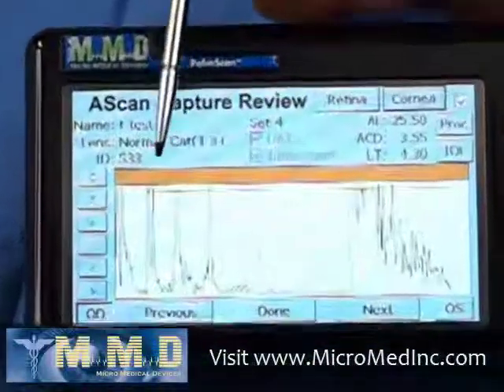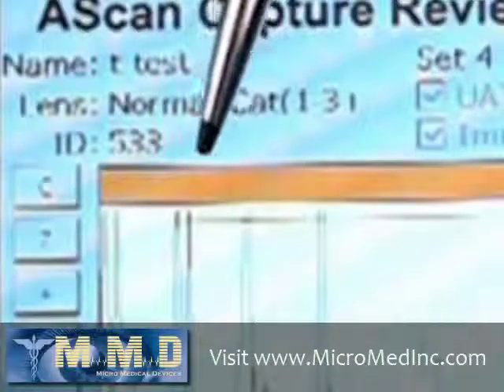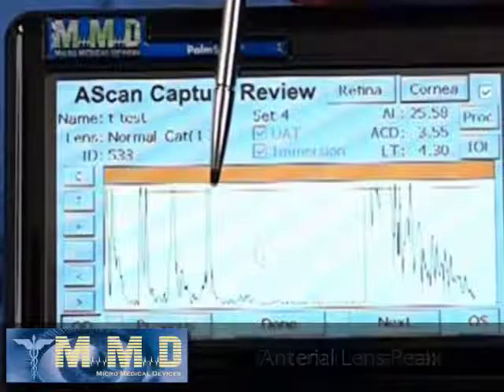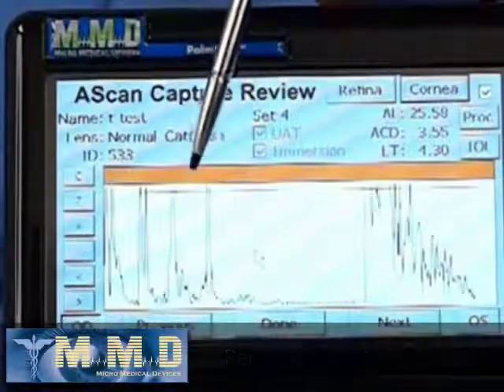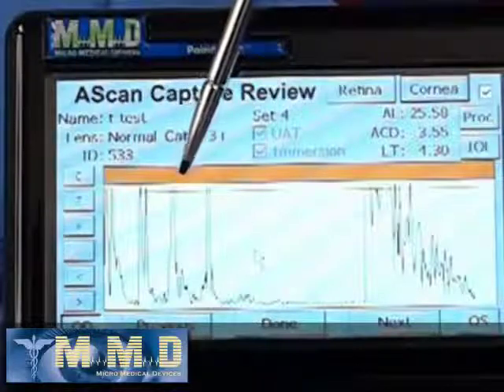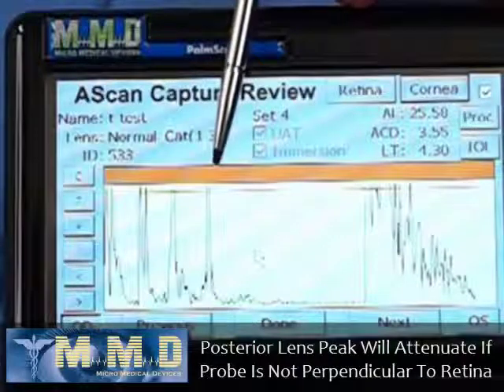The machine will reach threshold for capture when the specific structures of the eye are above the threshold line. Specifically, the machine is looking for the corneal peaks, the anterior lens peak, the posterior lens peak, and the perpendicular retinal peak. Now, if the patient is not directly looking at the probe, so if the patient's retina is not perpendicularly aligned with the probe, the number one peak that would be reduced or attenuated would be the posterior lens spike.